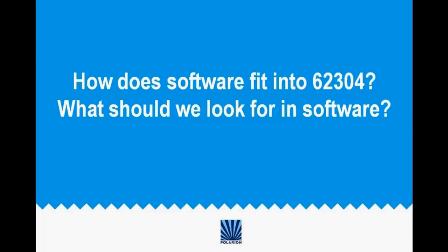One of the things is, with 62304 people tend to focus on the software development aspects of it, but development is a very broad sense. I've worked with clients who make very thin software that really is, all it's doing is gluing together existing systems that are touching medical information. And in those particular cases, they don't necessarily perceive themselves initially as developing software, but they are.